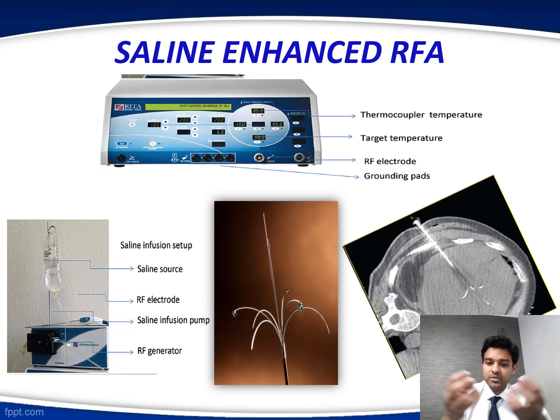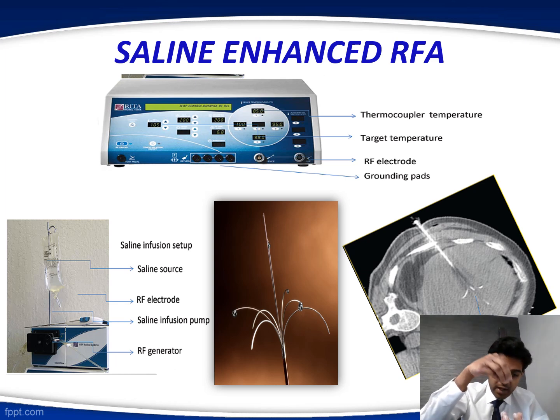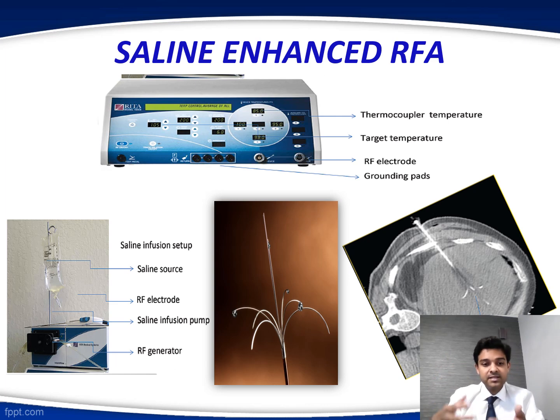As these microbubbles move to the periphery, the moisture at the center, where we require the region to be ablated, diminishes. As I said before, when RF alternating current is passed, it is the dipole water molecules that start to vibrate rapidly. So if there is less moisture, there are fewer water molecules. If there are fewer water molecules, there is less electrical conductivity and less heat generated. And so the ablation is less.